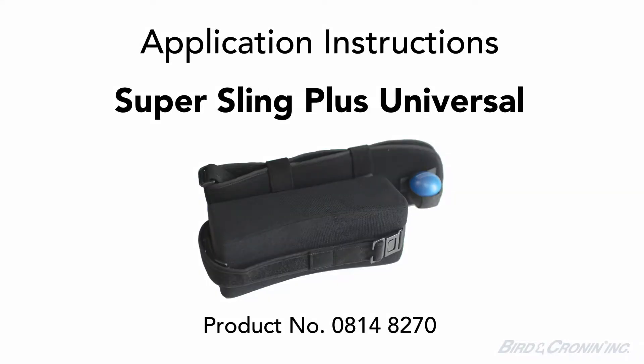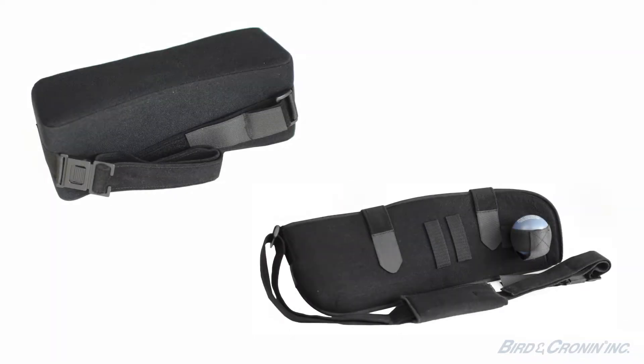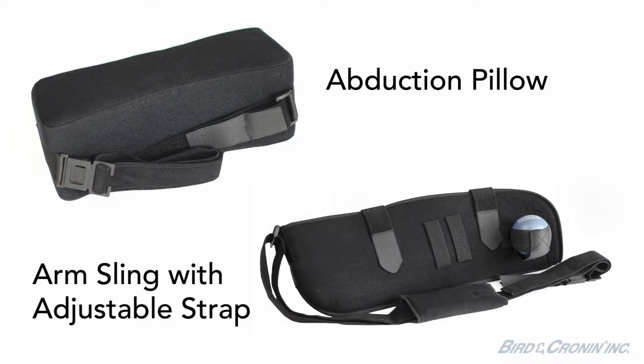Today we will demonstrate the application of the Super Sling Plus Universal, product number 08148270. There are two major components to the Super Sling Plus Universal: the abduction pillow and the arm sling with adjustable strap.